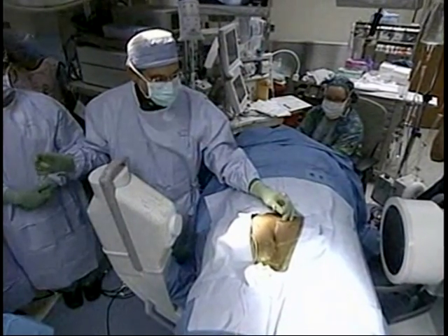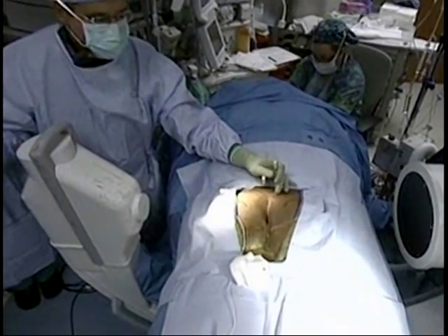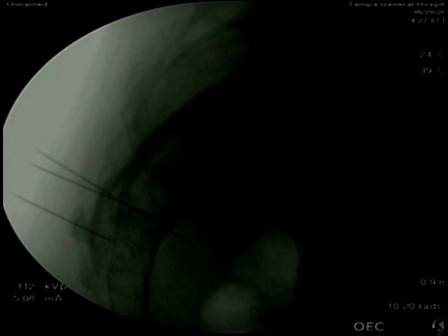Dr. Odorica is trying to get into the S4 foramen. He will be using fluoroscopy, and as the needle passes you can see it going down along the foramen, just below the level of the bone. He likes to get it just below the level of the bone so he can get the best stimulation — the nerves run just below there.